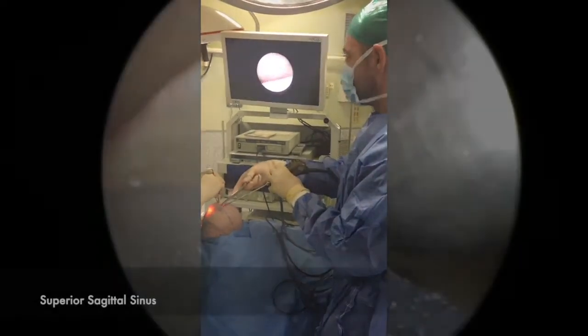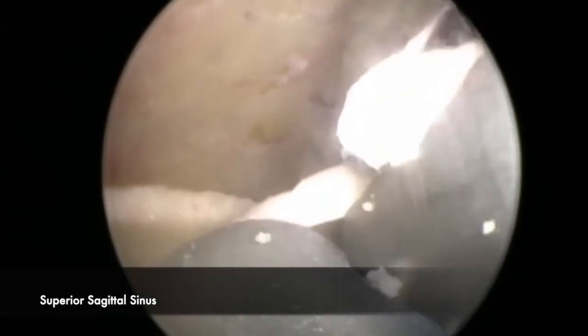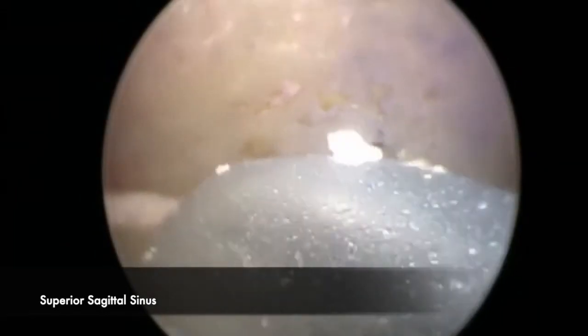This is an endoscopic view of the model, showing the superior sagittal sinus just below the sagittal suture. The scaphocephaly model has a really good representation of the sinus. Trainees can try to push down the dura and take out the overlying bone.